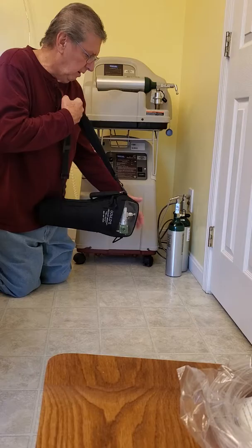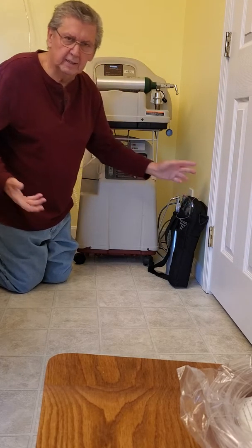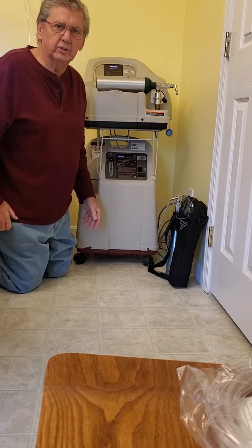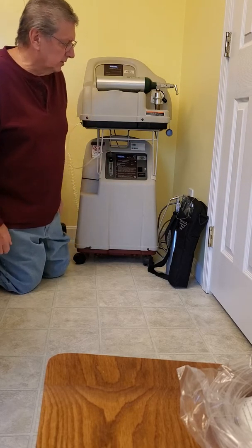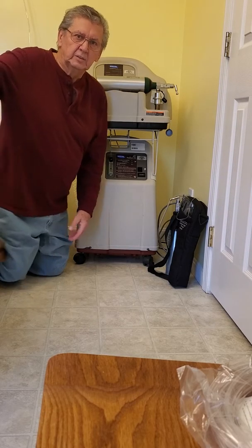So that's just some quick and easy tips on what I recommend you have if you're on home oxygen therapy and if you want to take a short trip somewhere. Thank you, and y'all have a good day.